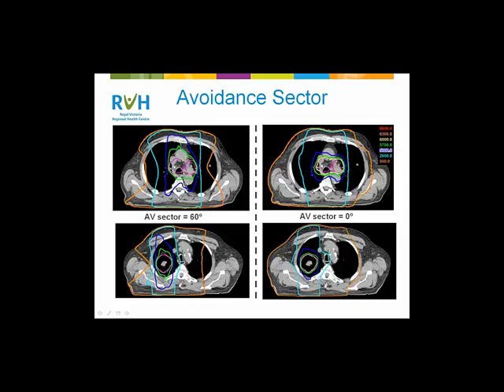The other thing to keep in mind is this patient that we see here. Here's a fairly small isolated tumor. This is not the norm with these patients, right? They usually have a large tumor adjacent to other tissue, and the effects of buildup aren't quite as significant. But again, it also helps to have a large field size, so that you're getting some scatter in towards that buildup region as well.